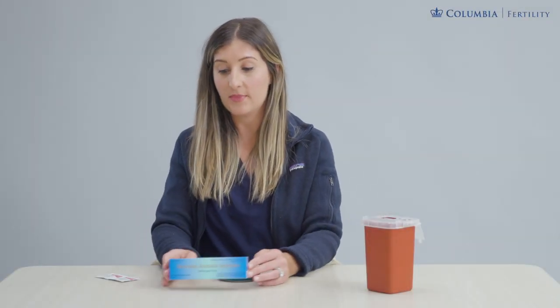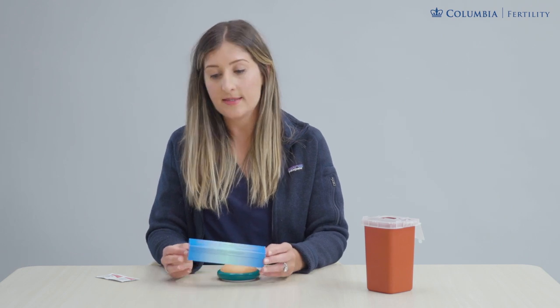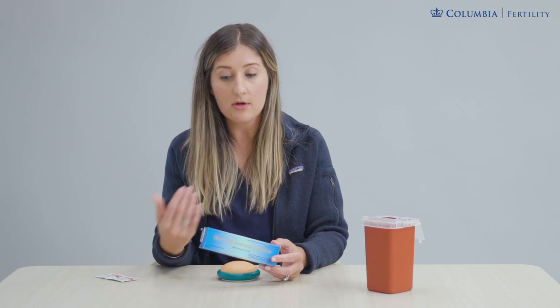Welcome to the Ganorelix injection video. We're going to be showing how to administer your pre-filled syringe of Ganorelix. Please confirm with your care team that this is the evening that you should be starting this medication. This is typically something that's started towards the middle to end of your treatment cycle and they will give you an exact night to start this.